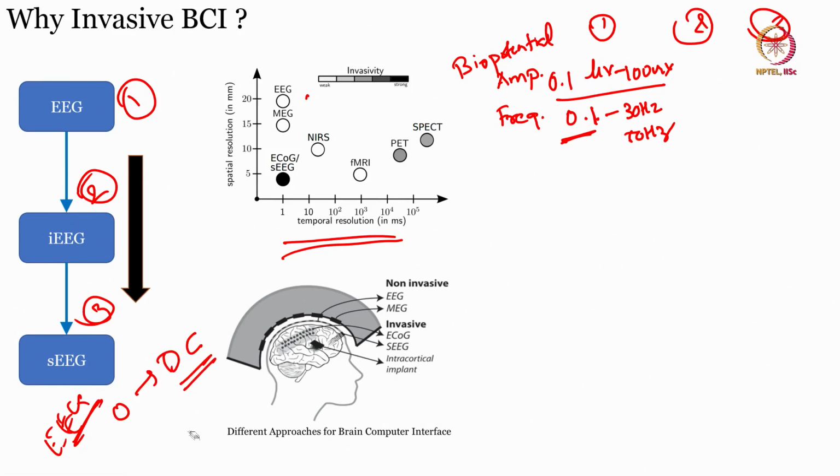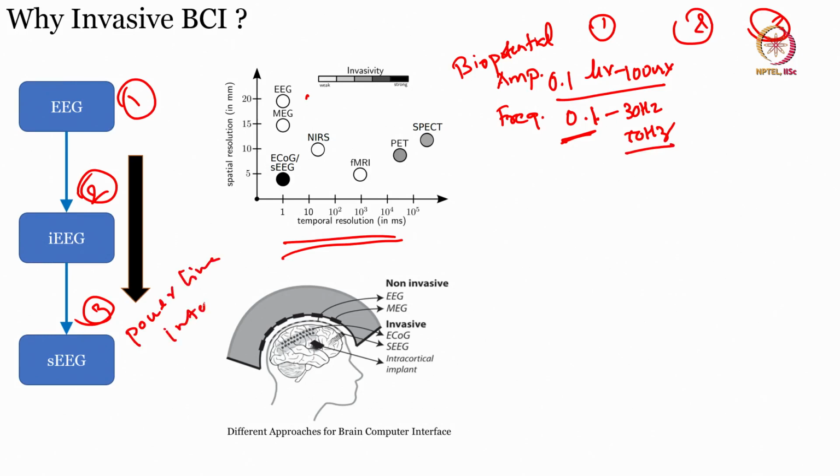In most EEG or ERP based amplifiers or band pass filters, you will see either 0.1 or 1 or 3 to 30 hertz, something like that. Also, when I say 50 hertz, I need to take care of power line interference. We will come to all this in detail in the experimentation class, but why power line? Because we are in India.